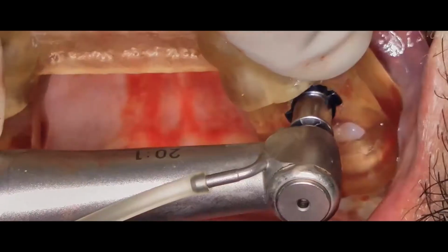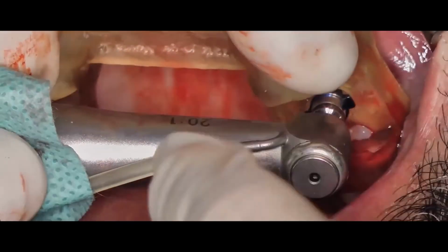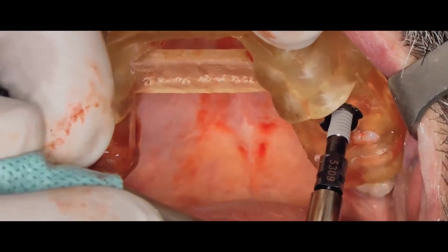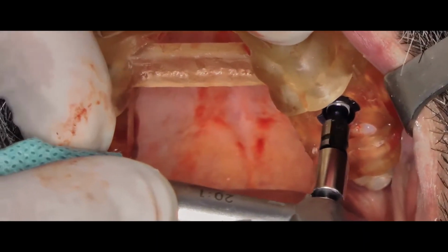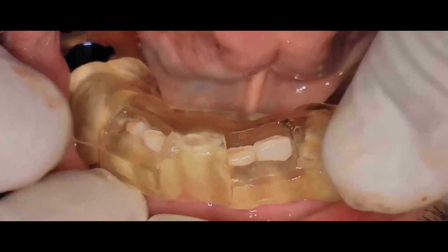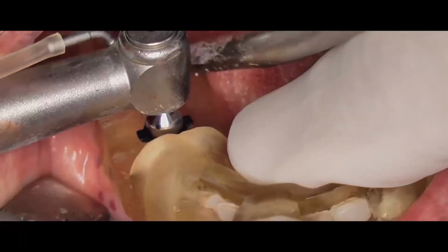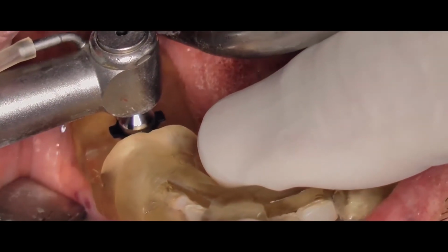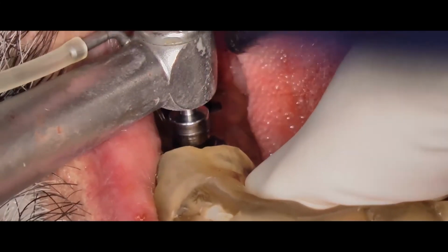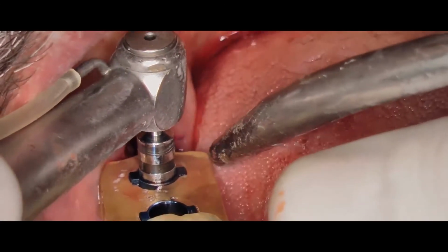What you really should be doing is select a case like this one. Cases where teeth have mobility, unusual anatomy, post-extraction, severely resorbed ridges, etc. are probably better left to be treated with a freehand approach if your experience with guided systems is limited. If you are experienced in guided surgery, on the other hand, you will surely benefit greatly from a very precise surgery on complex cases.